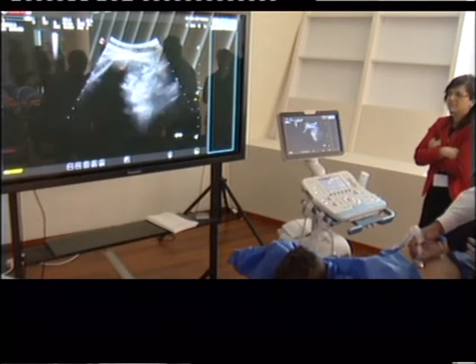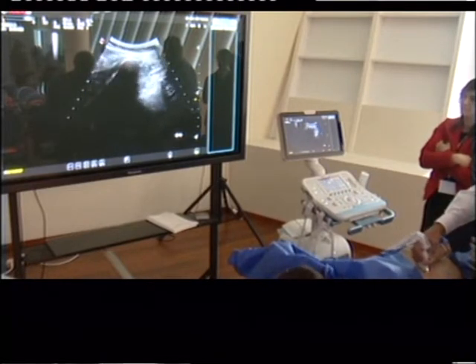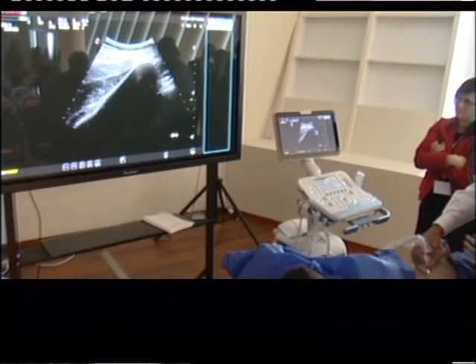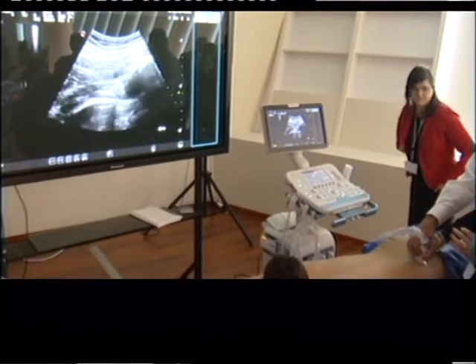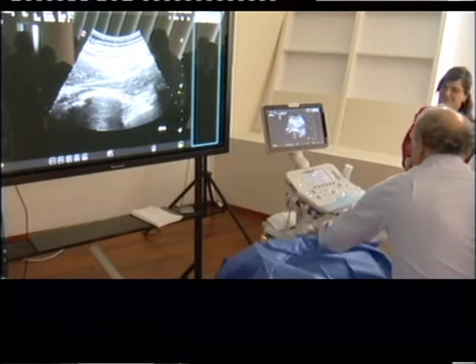Right at the tip, the sacroiliac joint is here. The cluneal nerve is up top. Now watch the maximus get bigger and go away. And now piriformis.